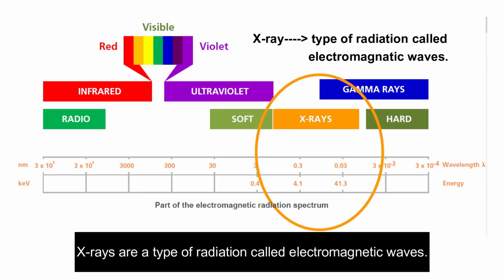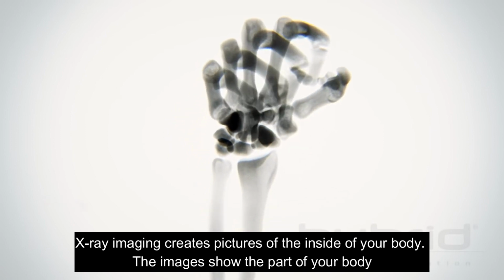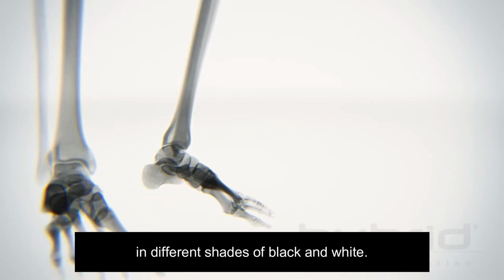X-rays are a type of radiation called electromagnetic waves. X-ray imaging creates pictures of the inside of your body. The image shows the parts of your body in different shades of black and white.